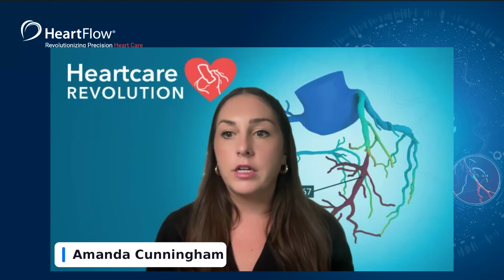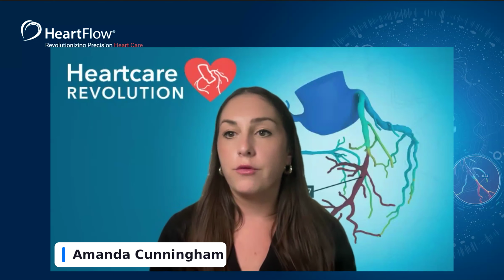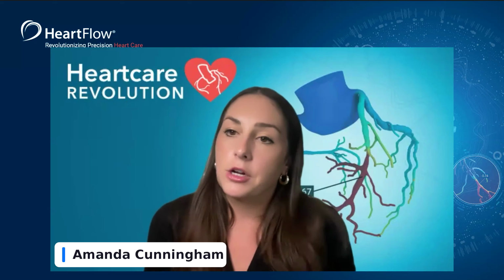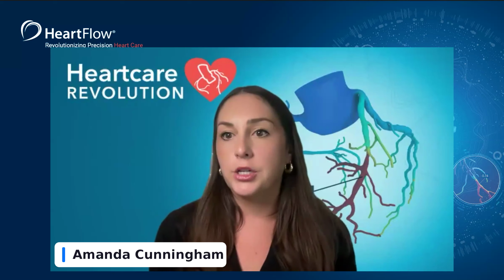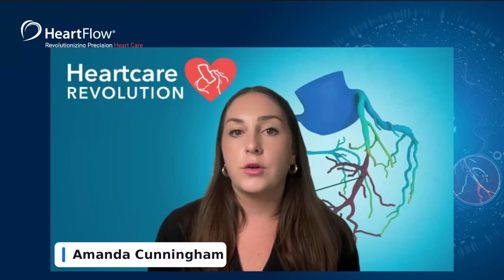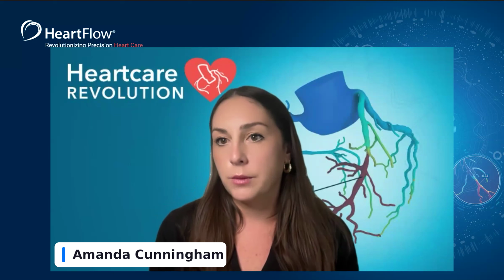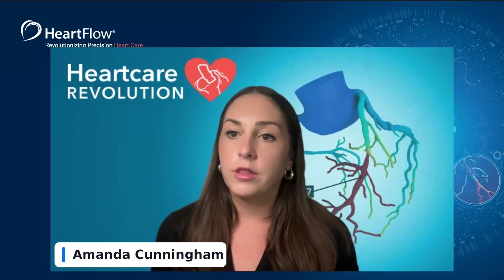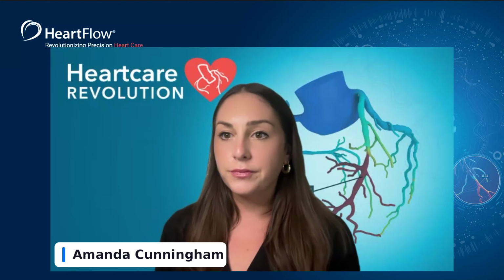It's good to have a baseline number, like if you can't get below 75 or if you can't get below 80, then you need to call me. Because they're going to be the ones reading it, but it does depend on patient condition, patient BMI, and what scanner you have. So there's a lot of factors that go into play, but just knowing your protocols and your scanner and your patient. So it's best to just come up with something collaborative with the reading physician.